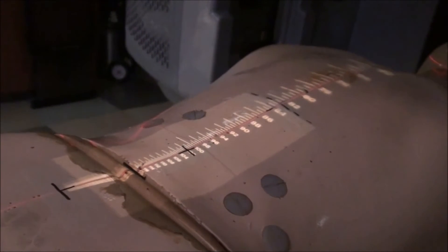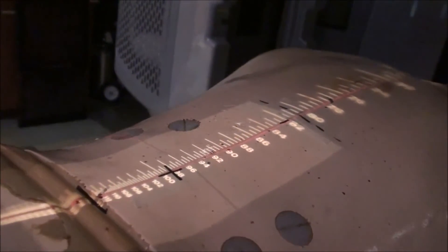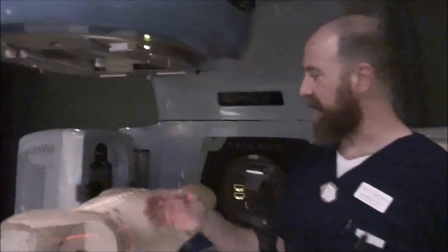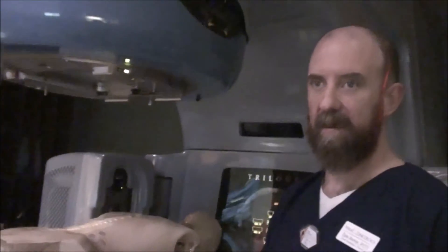If we tried to match directly to the previous match line without resetting depth, we'd find we were supposed to be at 96 but now we've got a difference of over half a centimeter. We don't want that. We want our matches to happen at the correct depth. So at 96, matching there, now we execute our gap. Let's say our gap is one centimeter. We line up to the match line and then move the patient in one centimeter — I recommend using the digital scale on the monitor. Now we've got a one centimeter gap. Double check your SSD; within one centimeter it should be pretty good. Now you can treat this field as well.